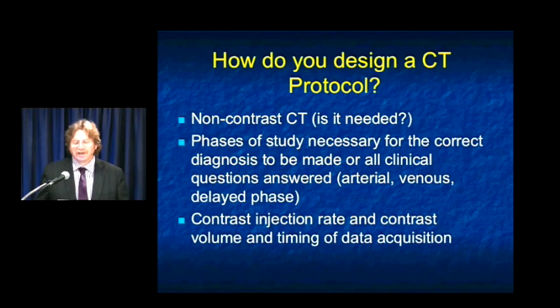I always ask the question in meetings, how often have you changed your protocols? How often do you look at your protocols? People rarely raise their hand because people haven't checked their protocols. I think it's very important at a minimum every year to look at all of your protocols, make sure they're up to date, make sure the protocols are where you need to be, make sure their doses are as low as possible, make sure the protocols are well designed, there's no confusion. If you do it once a year, I think you'll be in good shape. On CT, as for us, we update once a year, and you're going to see a lot of updates very soon from us, literally in the next several weeks.